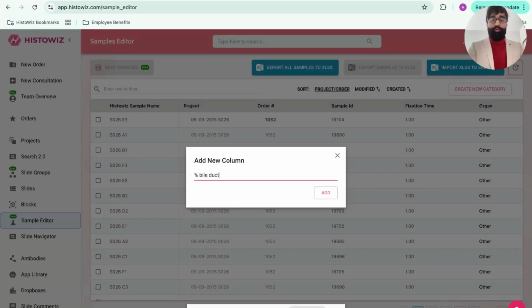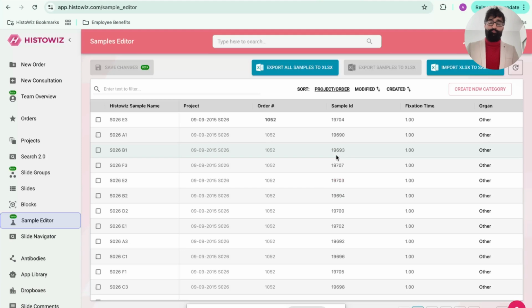Now, the way in which you can populate these fields could be done in two ways. One is you can import a spreadsheet with that information, and we do a simple sample name to sample name matching and populate it for you. Or if you have used AI analysis on the platform directly, we automatically populate the metadata based on the analysis.